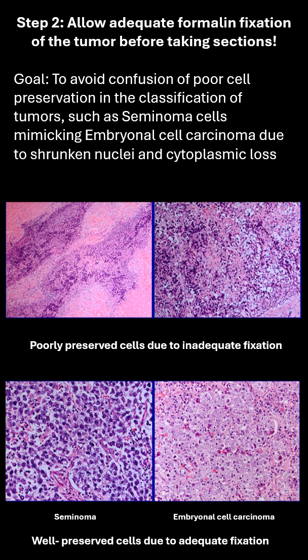cellular crowding, and that may result in over-interpretation of seminoma as embryonal carcinoma, while this particular example shows nicely preserved tumor cells showing the characteristic morphology of seminoma and embryonal carcinoma.